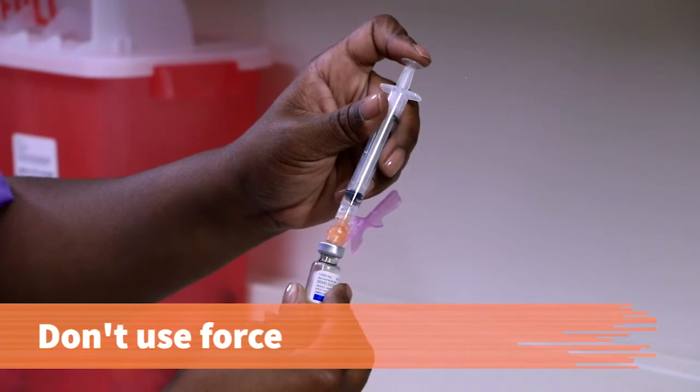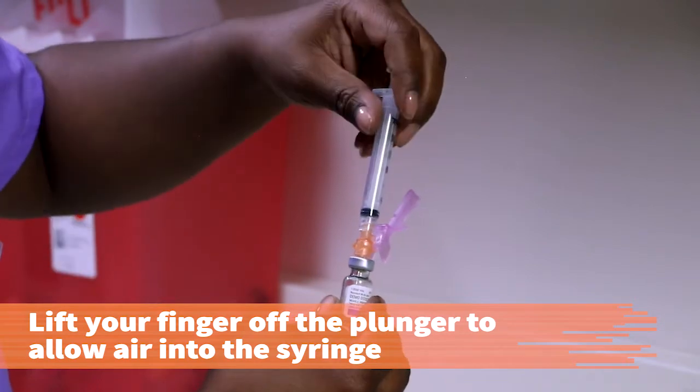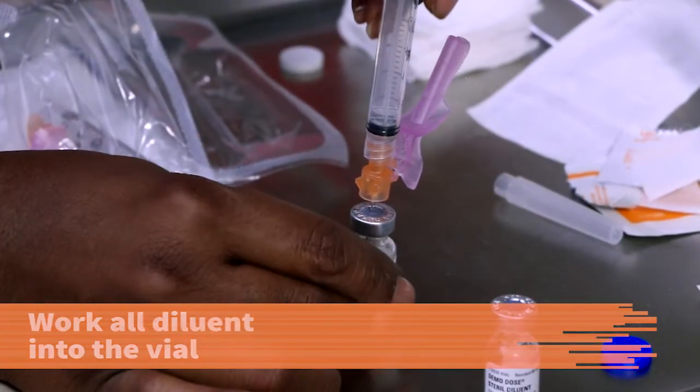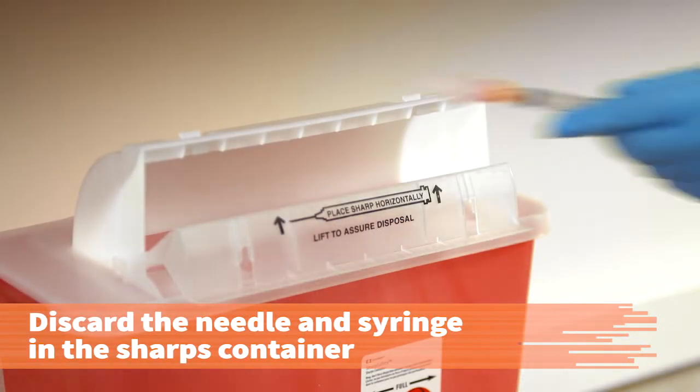If you meet resistance, don't use force. Lift your finger off the plunger and allow air to fill in the syringe. Gradually work all the diluent into the vial. Withdraw the needle from the vial. Discard the needle and syringe in the biohazard sharps container.